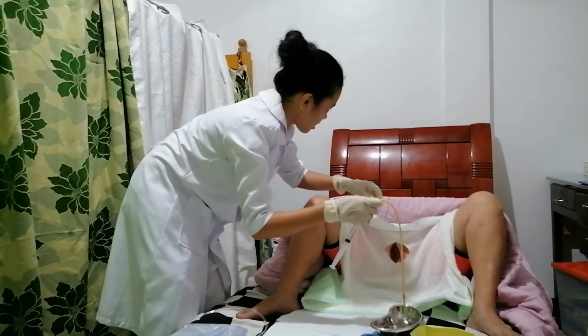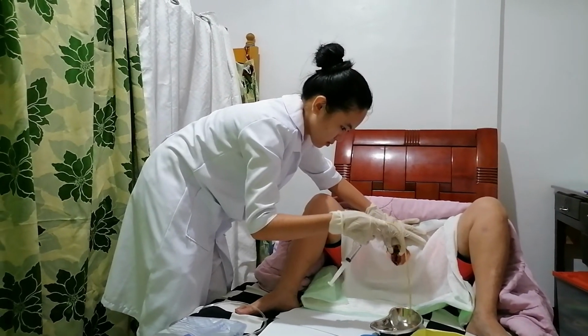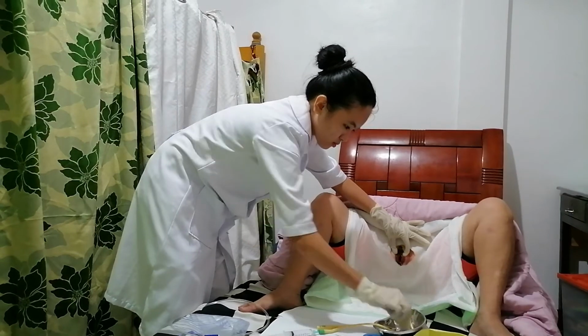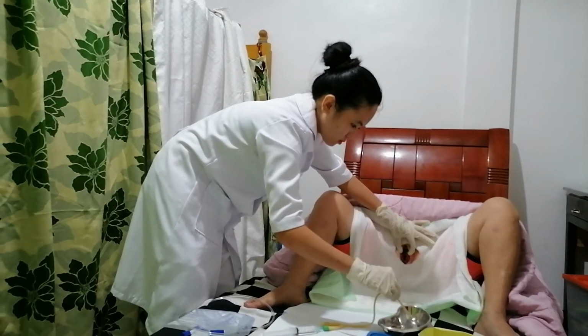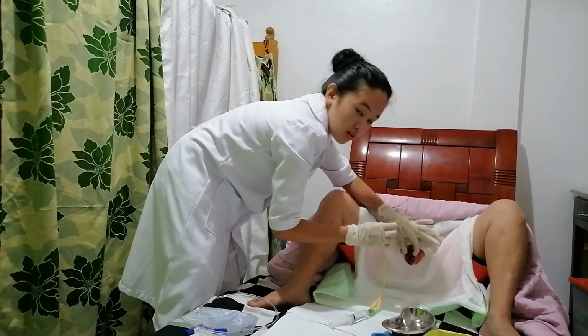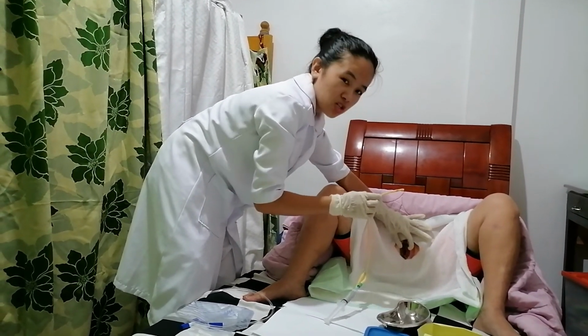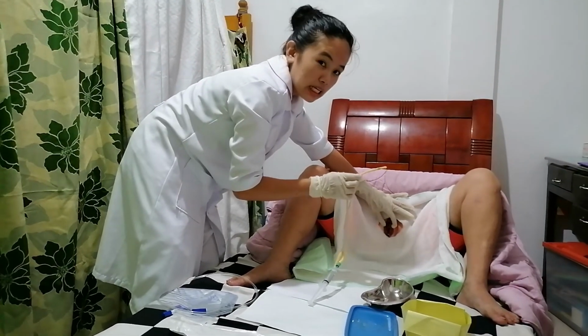Ma'am, kapo na ako, ma'am. Ma'am, hingang malalim. So now, I'm going to insert the catheter into the patient, about 2 to 3 inches.